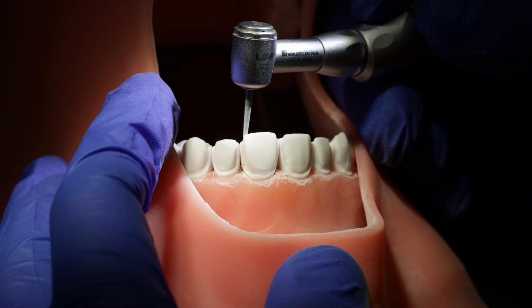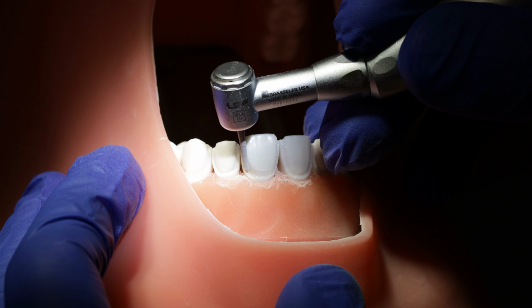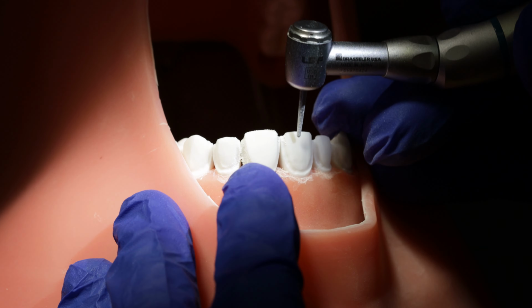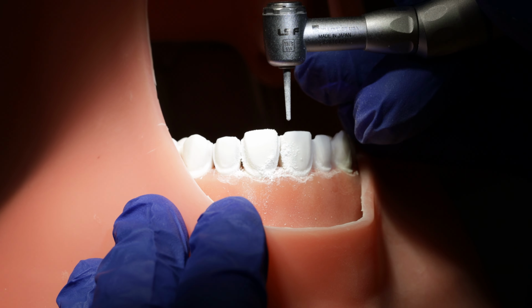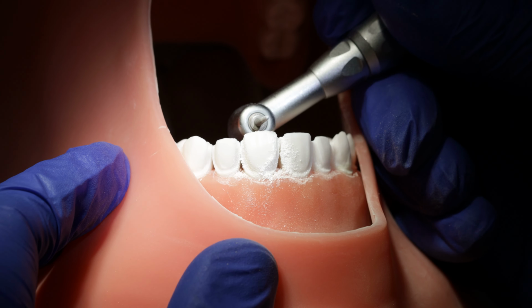Today's magic number is 0.5 millimeter for all of the surfaces we're reducing, at least 0.5 millimeter. This 0.5 millimeter applies to the mesial reduction, the distal reduction, the lingual reduction, even the facial reduction, and right now we're working on that incisal reduction.